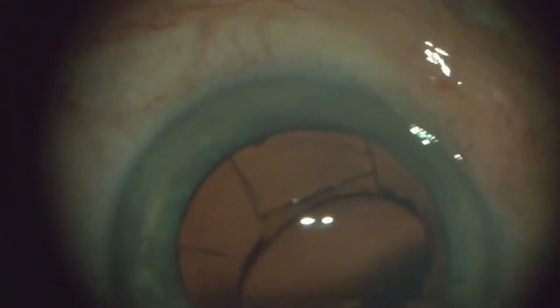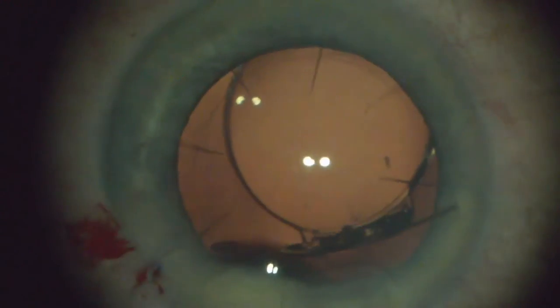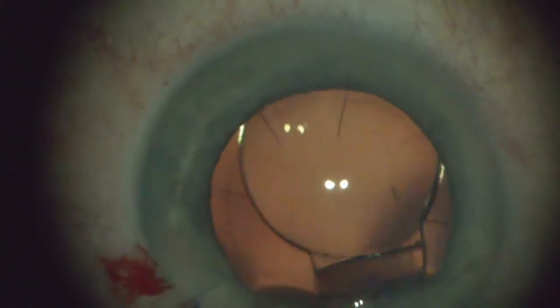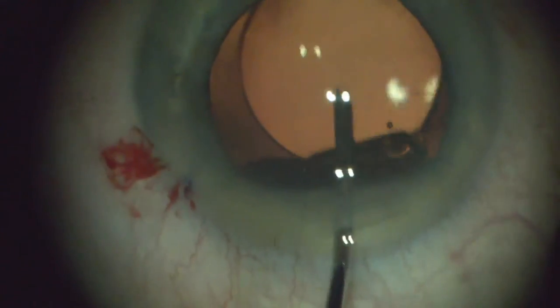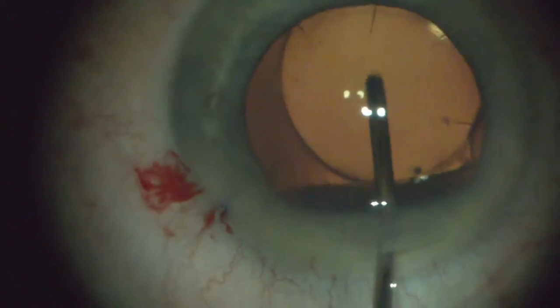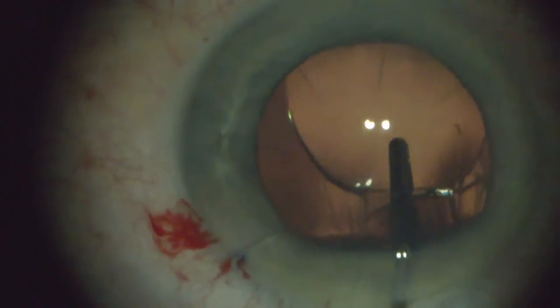I put the leading haptic into the bag, and then I push with a stylet the trailing haptic. I try very hard to use the second instrument to place this lens in the bag. You have to make sure that the trailing haptic goes in the bag, so I kind of rock the lens almost to the point and push it so that I know all four haptics are in the bag. If not, this lens does not perform well at all.